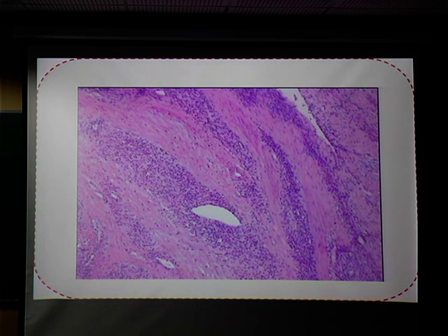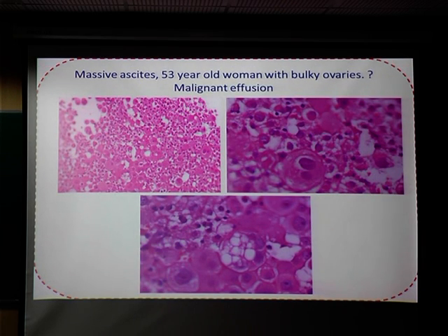And we did receive that single section of leiomyoma from that patient, and we critically looked at these slides, and there were small areas of necrosis, and we really thought that this was a very well differentiated leiomyosarcoma that has been metastasizing to the lungs and the pleura.